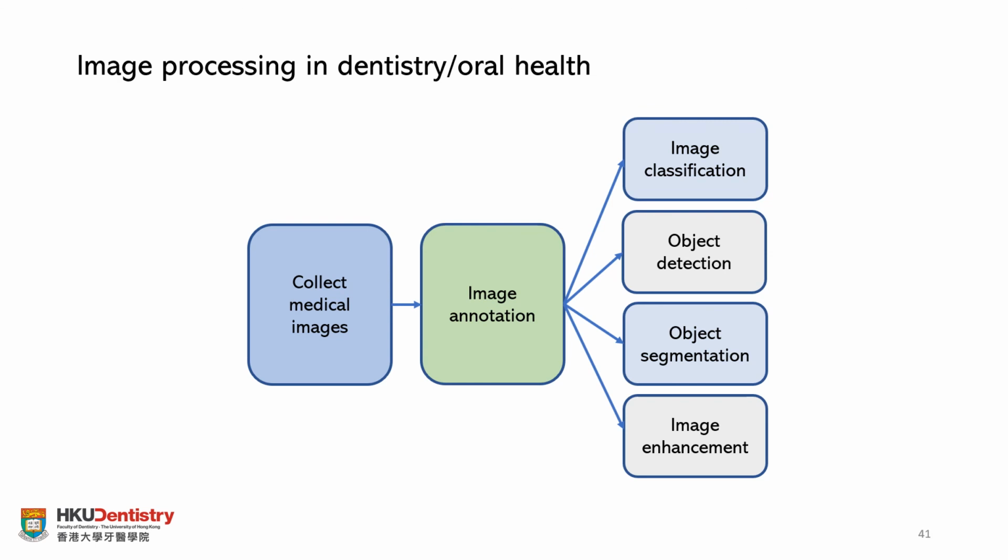The level of annotation depends on your final application and the final model that you plan to use. And it's very important that you are clear about what exactly you want to do and what kind of model you plan to use, and then go to the annotation phase and annotate your images based on your application and your model.